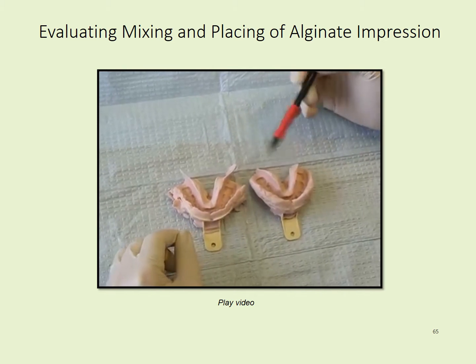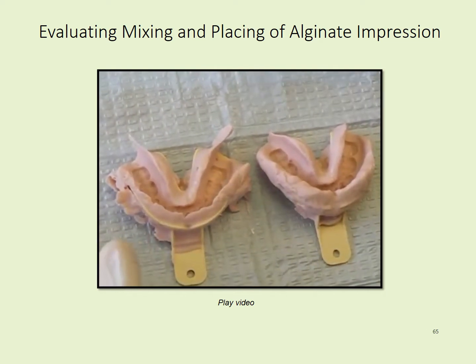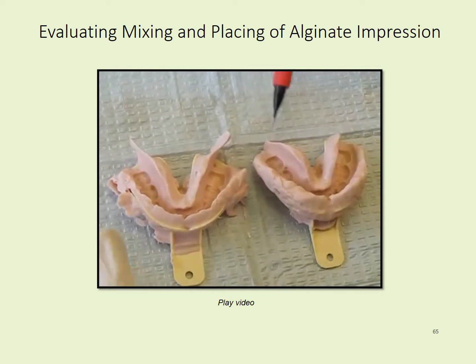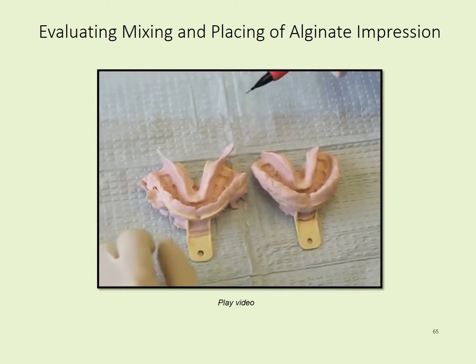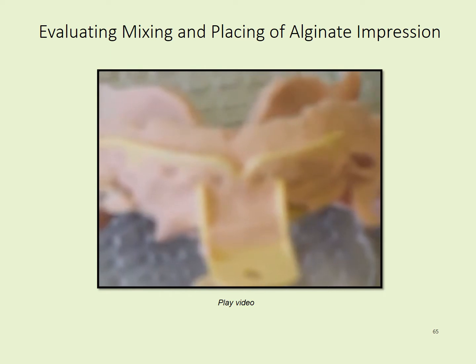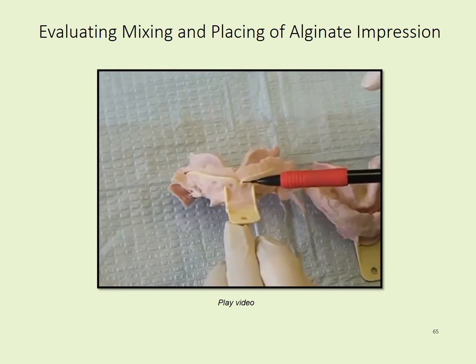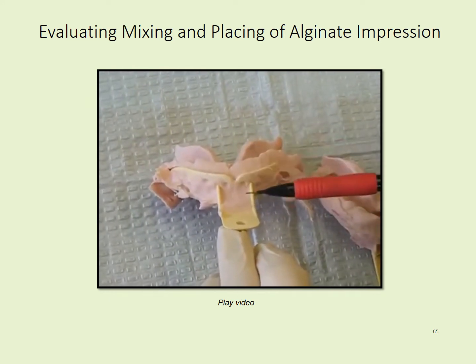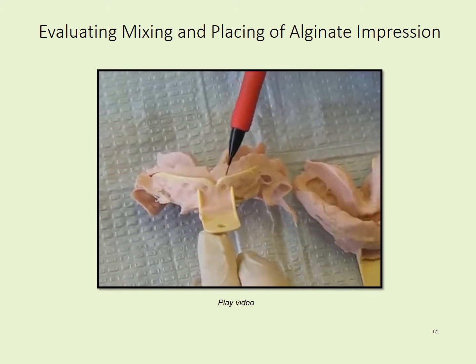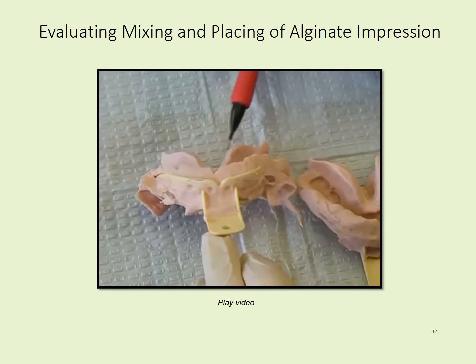Alright, we have 2 different impressions here of the exact same lower mandibular arch that I'm going to do a contrasting comparison with: one impression where the alginate was too runny and another one where it was the perfect consistency. First of all, let's view the very front of the tray. You can see here on this one where the material was too runny, you can actually see some of the actual holes, the retention holes, that are still visible. The material, the alginate, was actually pushed out of the way by the mouth muscles because the alginate was too runny. You can see a hole here, here, and here, and you can see that the tray is still showing through. I'll highlight it here with this pencil.